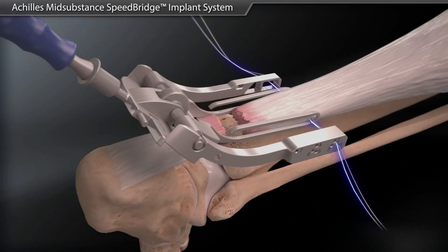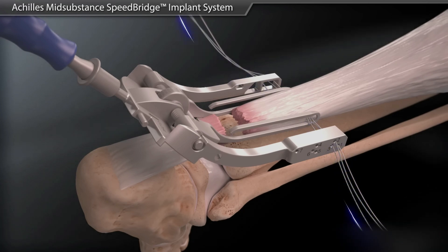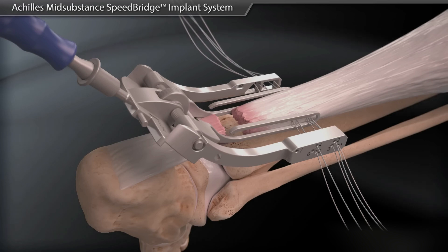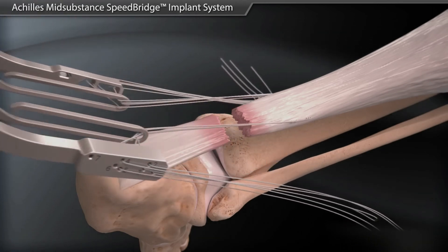The sutures are then passed through the jig and the tendon in a stepwise manner using the numbered holes on the side of the PARS jig. The jig is then removed, pulling the suture out of the incision.